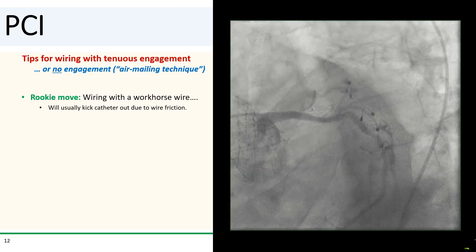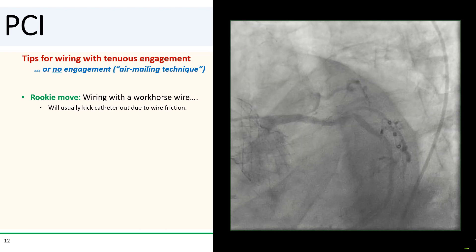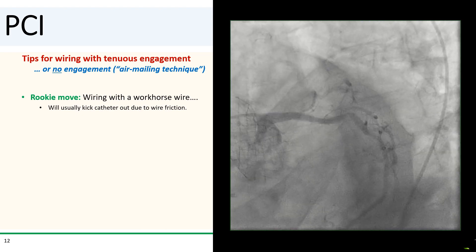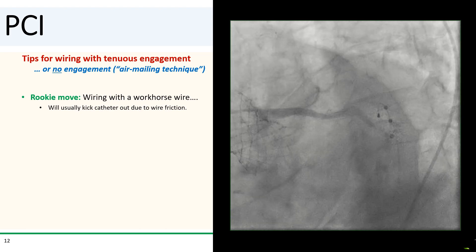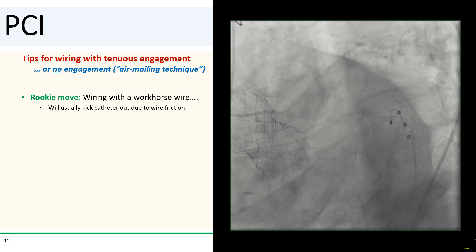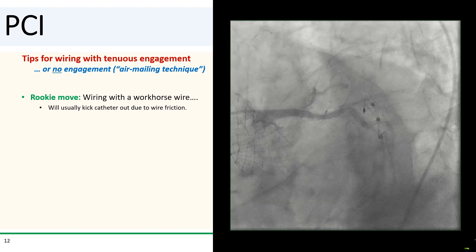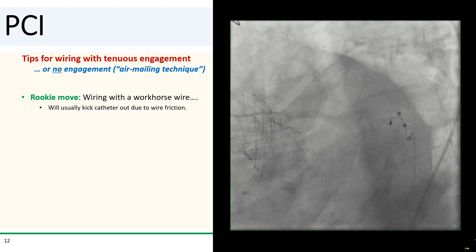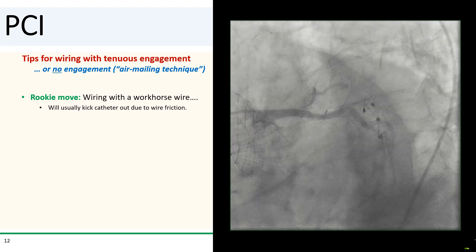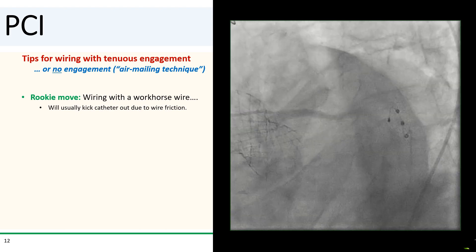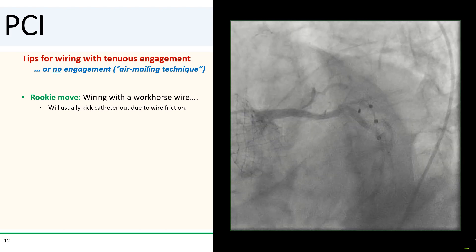Here are some tips for wiring with poor engagement or backup, or wiring with no engagement at all—the so-called air mailing technique. The rookie move is to treat this like any other PCI and just wire with your regular workhorse wire. That usually won't work because the friction between the workhorse wire and the vessel wall will generally kick out the guide before the wire makes it even past the proximal part of the vessel.